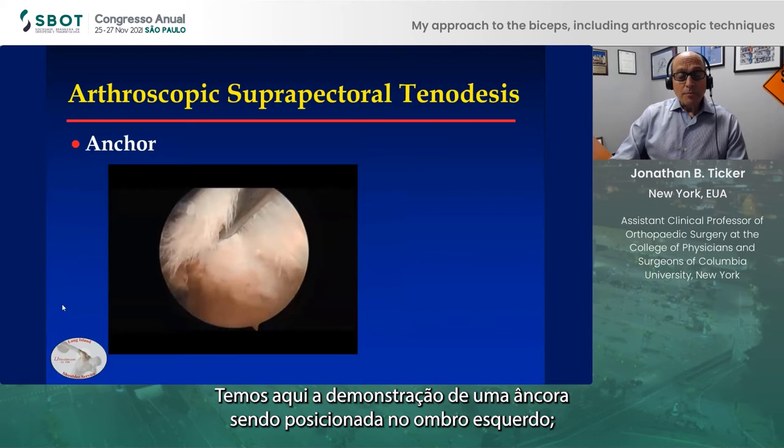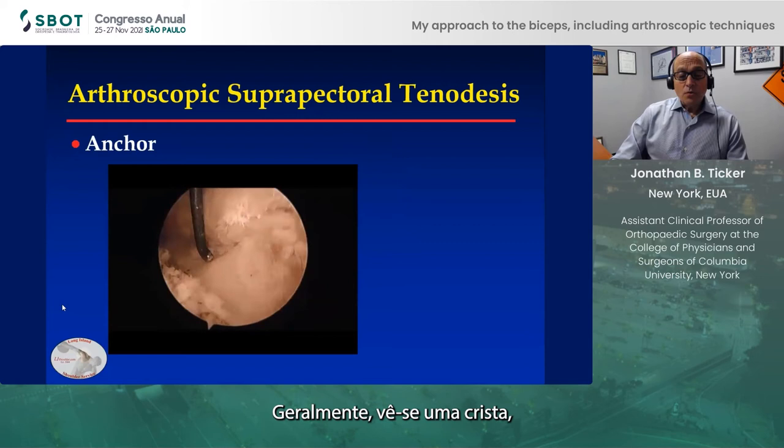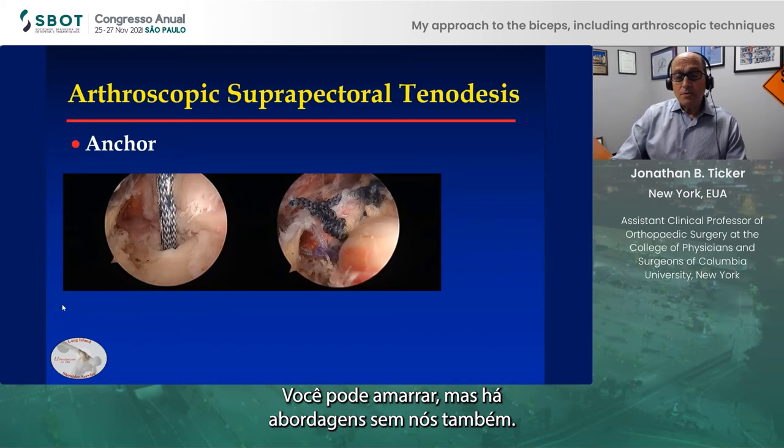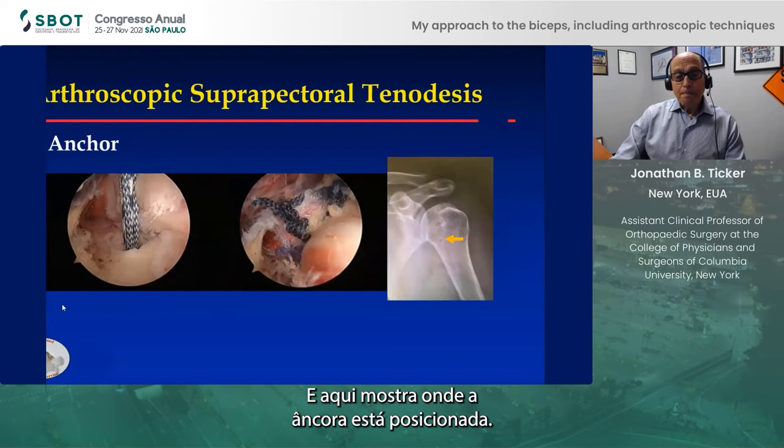This is the left shoulder demonstrating an anchor being placed, also in the suprapectoral region. You often see a ridge below the lesser tuberosity, so you know where you're located. I'll place an anchor, pass sutures through the tendon, tie them — there are knotless approaches as well — and this is where the anchor is positioned.